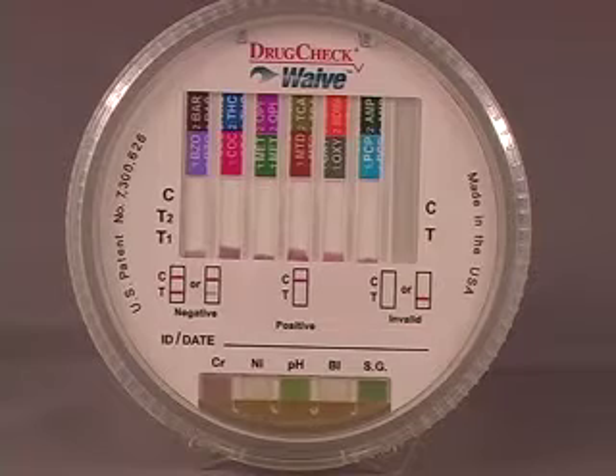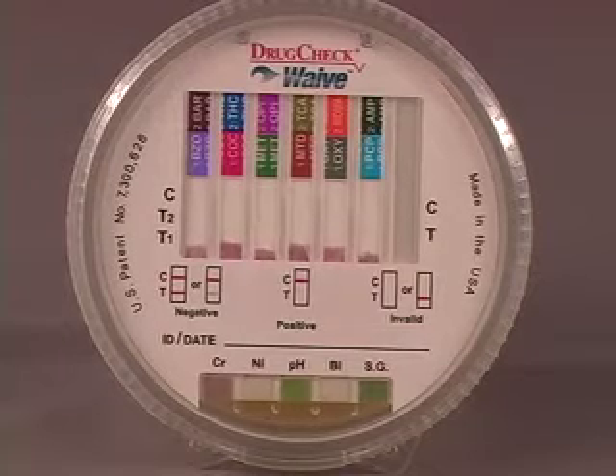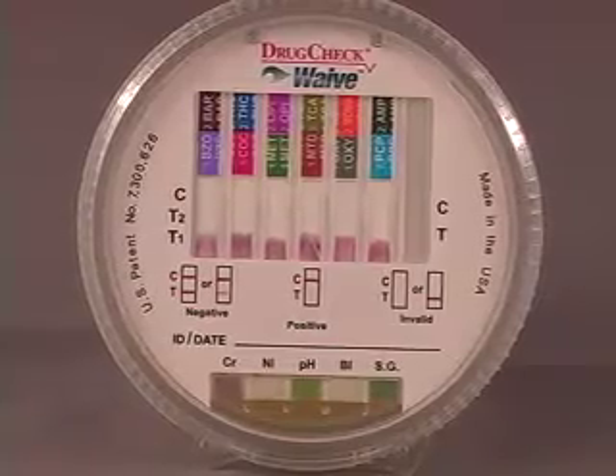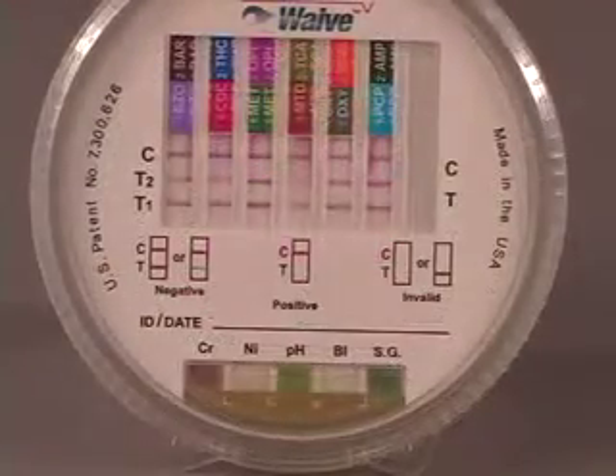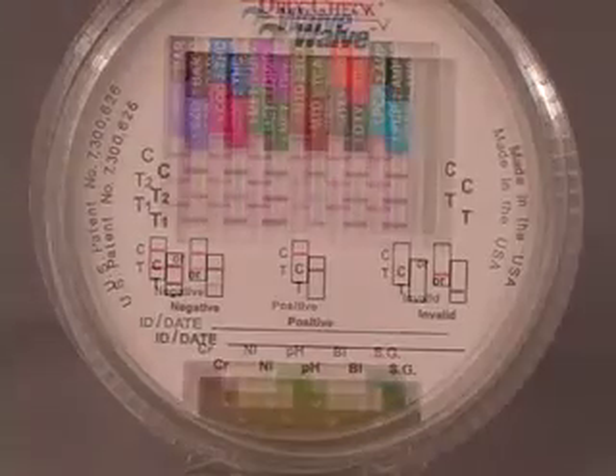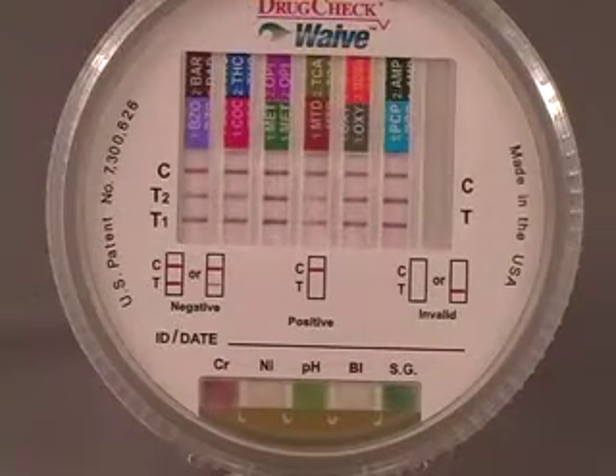The test strips begin to wick up the urine. Read results at 5 minutes. Do not interpret after 10 minutes.